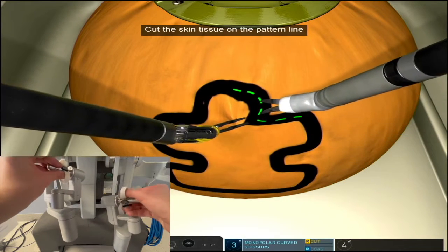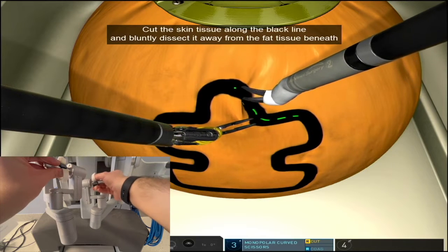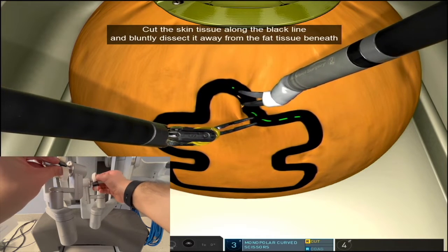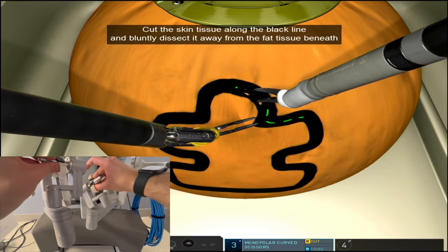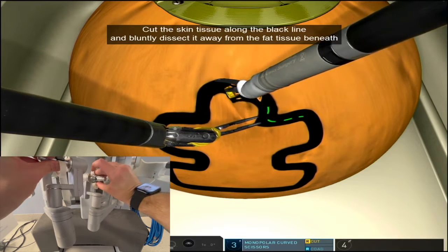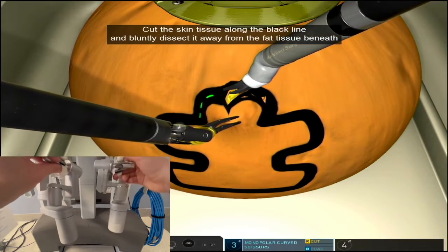You can just make a small hole to start with. It can be a little glitchy as an exercise, so bear with me. And you're gonna elongate that hole on both sides. It's okay to readjust your grasp.